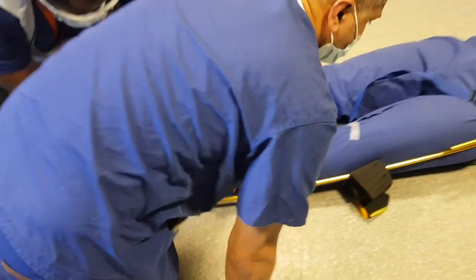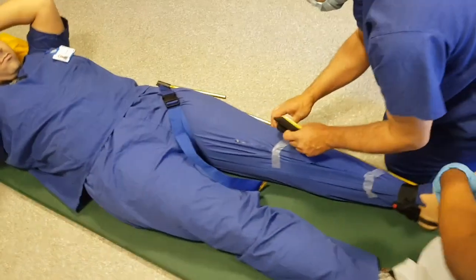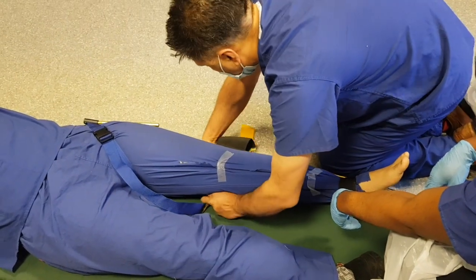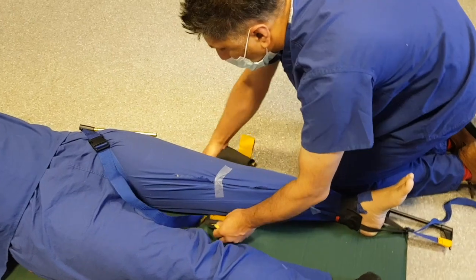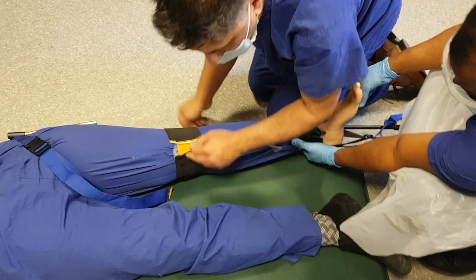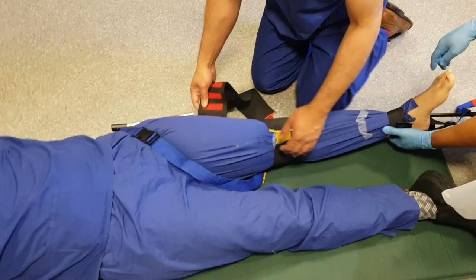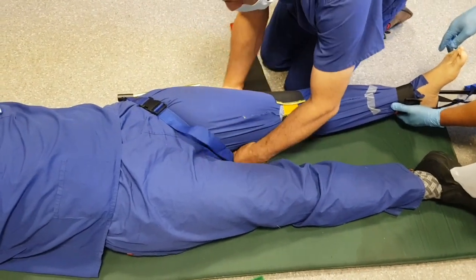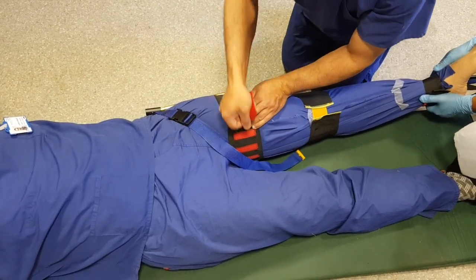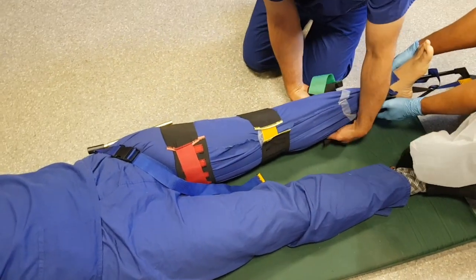Once I've done that, I've just got these belt-in straps. They're colour-coded — red, amber, green — so you know which direction to pull. You can also put padding in the side, which will help to make it more comfortable for the patient.